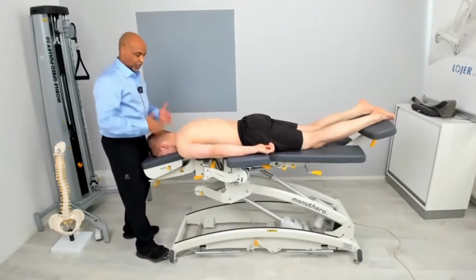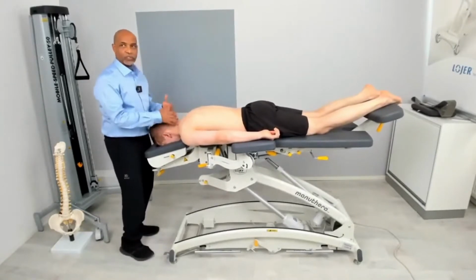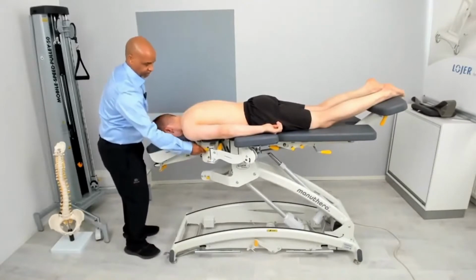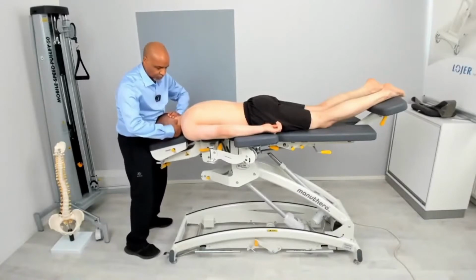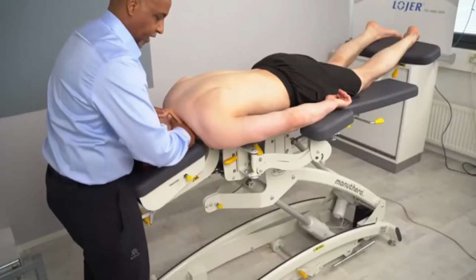Then I need to adjust the height to myself to make sure that I'm also very comfortable when I'm doing the treatment. The next phase is to activate the lateral movement. Because the neck is very sensitive, I need to consider how I'm going to mobilize the facet joint while I am stretching the neck.